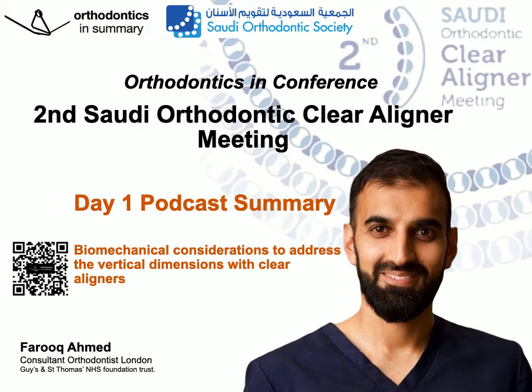A concept again built into the optimized attachments. Maz then moved on to describe deep bite cases, and the founding concept of deep bite case management is synergistic movements. The idea of when we procline teeth, we're also relatively intruding them as well. He described staging of deep bite cases. So first he looked at anterior-posterior staging, the idea that we want to procline the teeth to allow relative intrusion to take place as well.